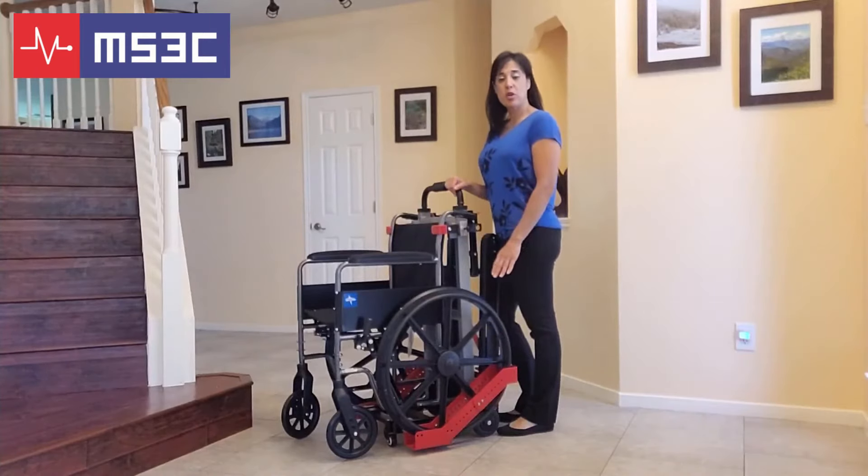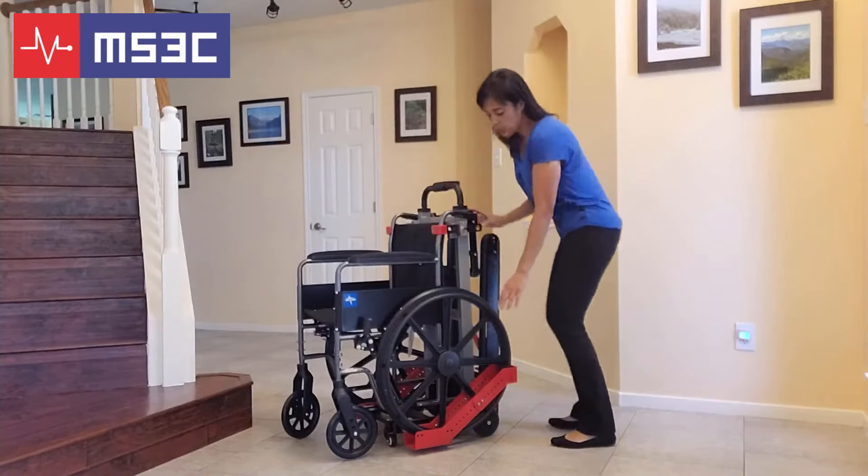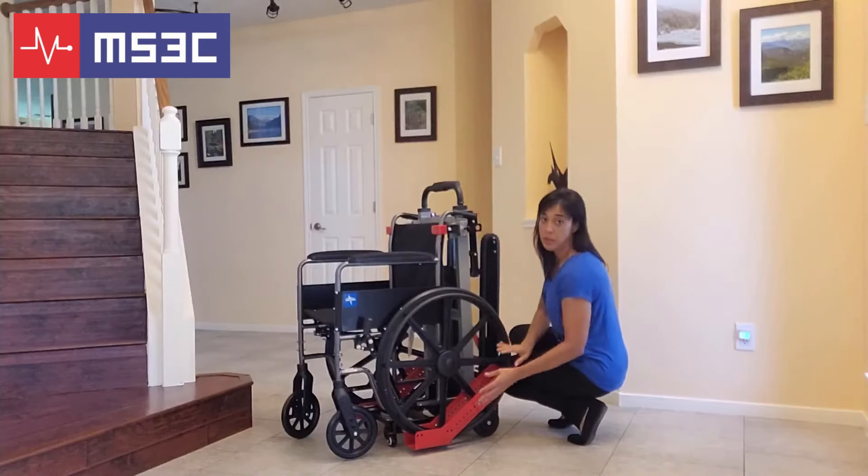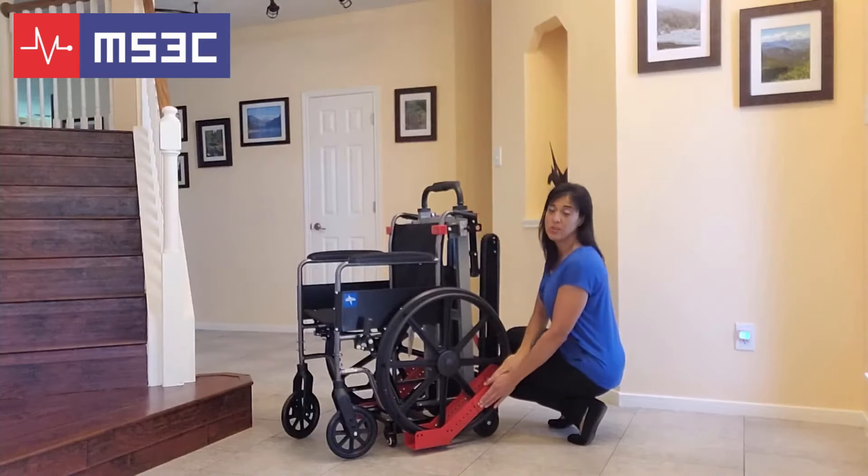The wheel supports on this trolley are also adjustable. We recommend at least a 14 inch wheel, and it can accommodate up to a normal standard wheelchair wheel. To adjust this track, you will simply remove the four bolts on each slide. You can adjust it up or down, and then re-insert the bolts and tighten.